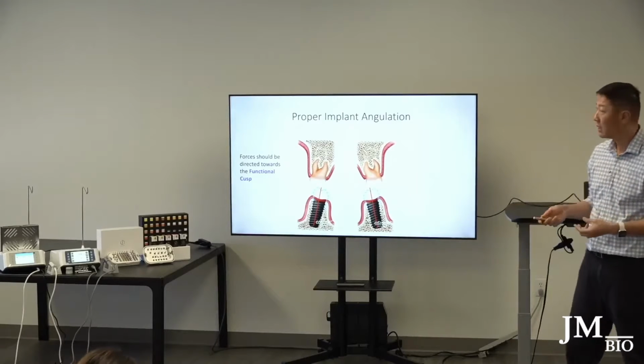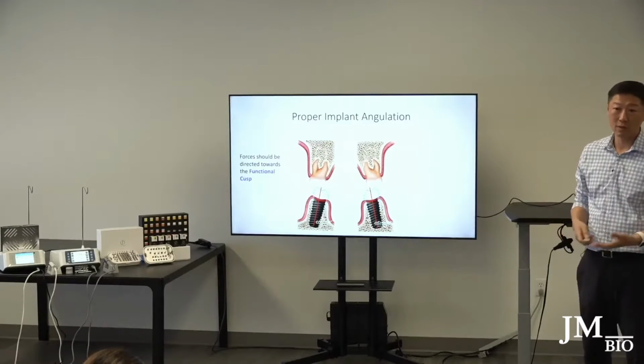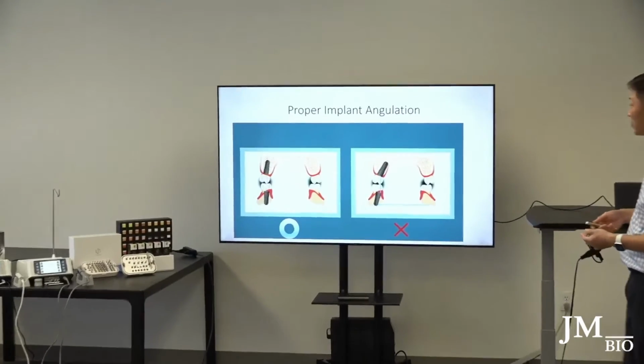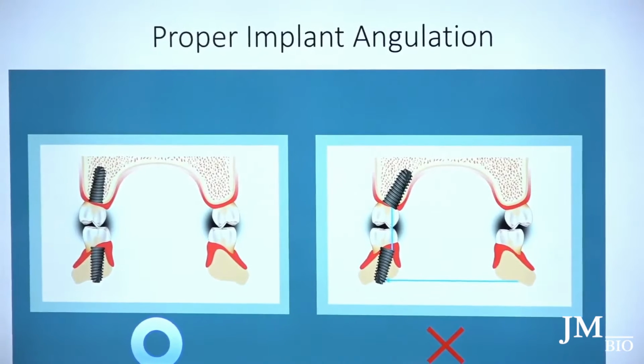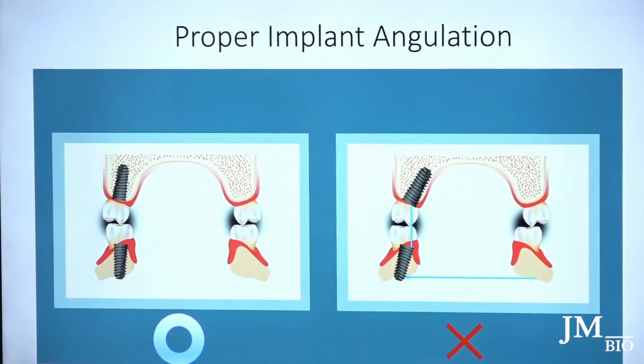So for long-term success, having properly placed implants is beneficial. It's so critical, so important. So once again, proper angulation. And try not to be satisfied with something when you take an x-ray and you're like, oh, that looks halfway decent, we can go with it. Step up your game. There are ways to correct it.